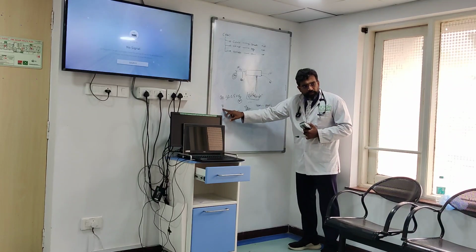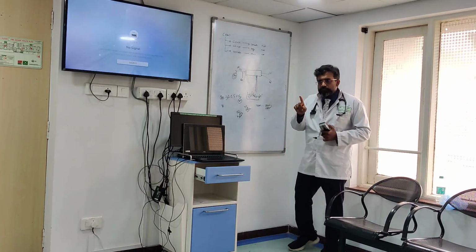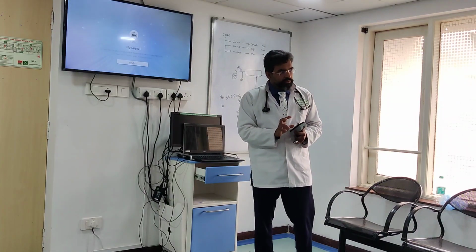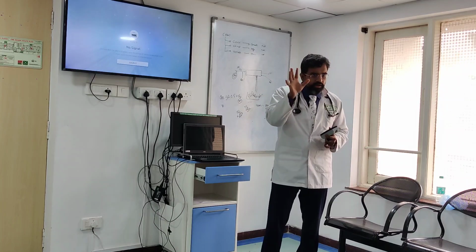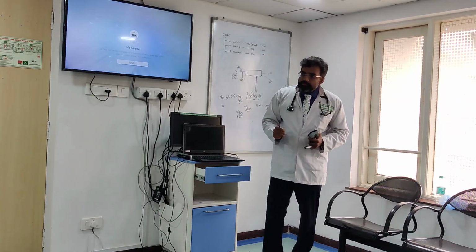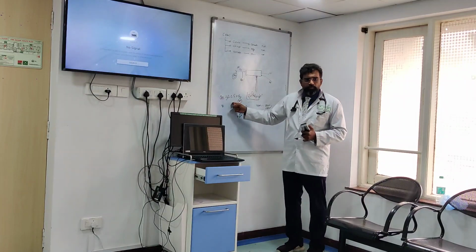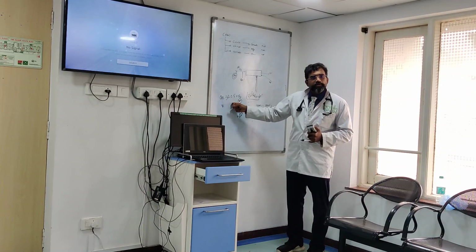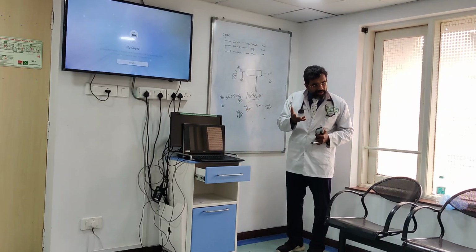What will happen to my filter? समझ में आया? So you don't reduce the blood pump flow just because the BP has dropped, because the filter will clot. So this equation you must remember, 2.5 times the dialysate. You understood, Sachin?